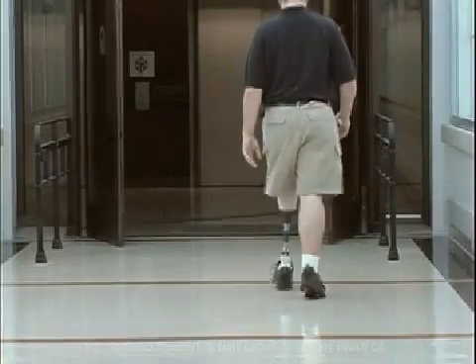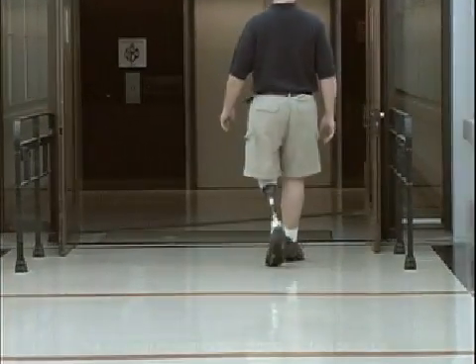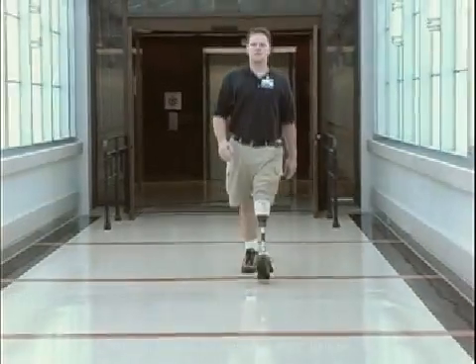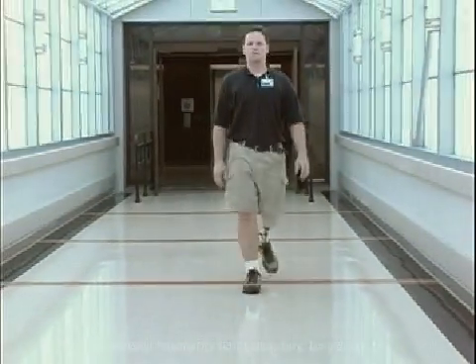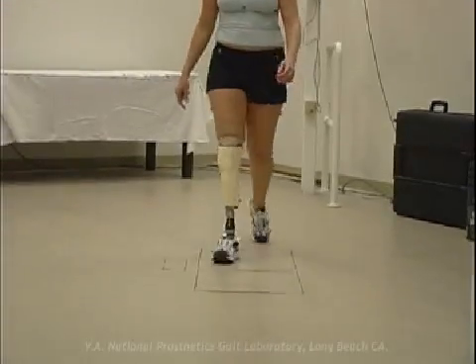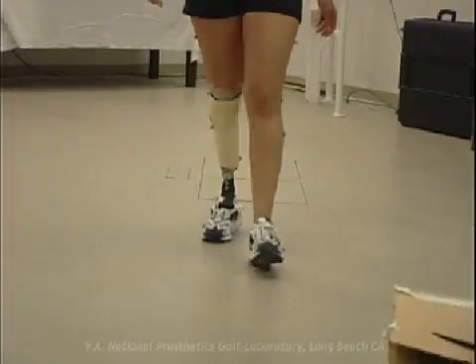The ultimate goal is a smooth transition throughout stance phase, resulting in balanced wear patterns on both the medial and lateral aspects of the sole. Careful attention to the rollover pattern in the coronal plane can ensure that balance.